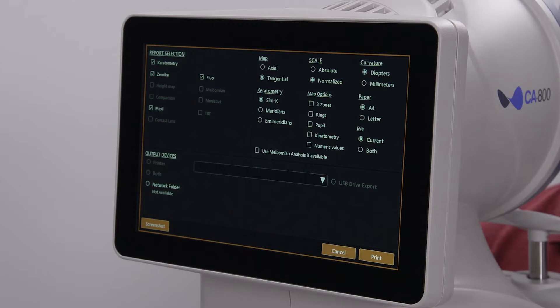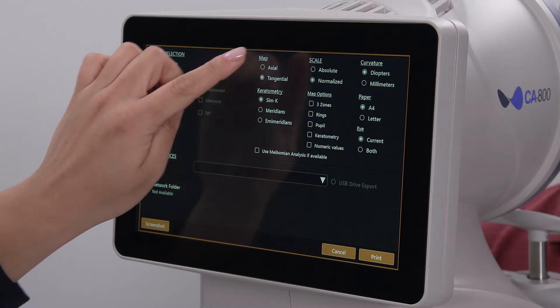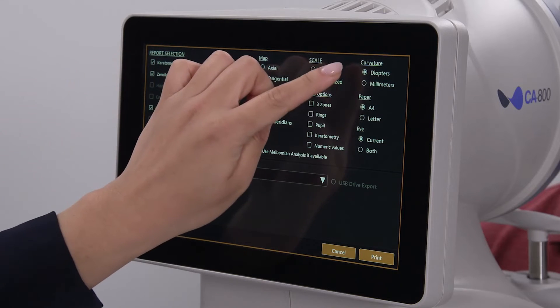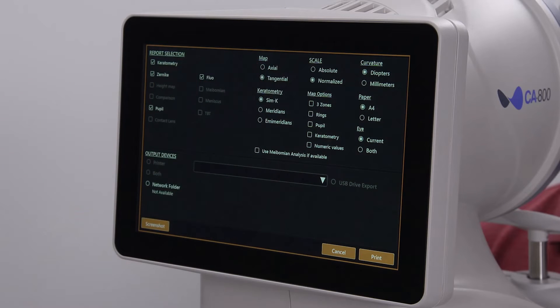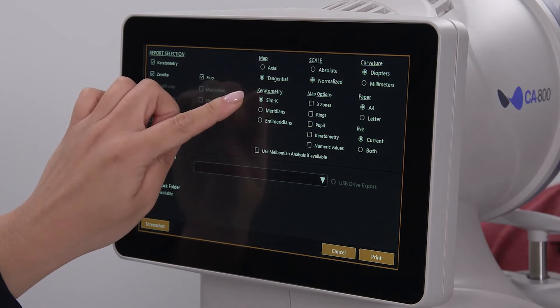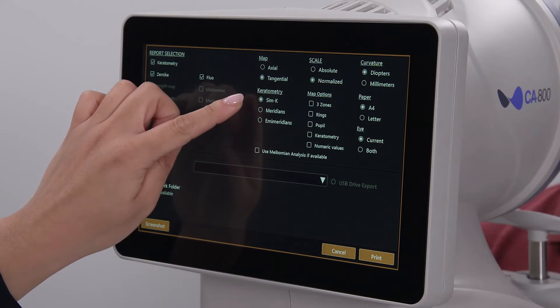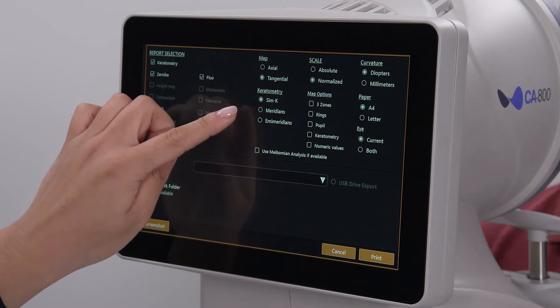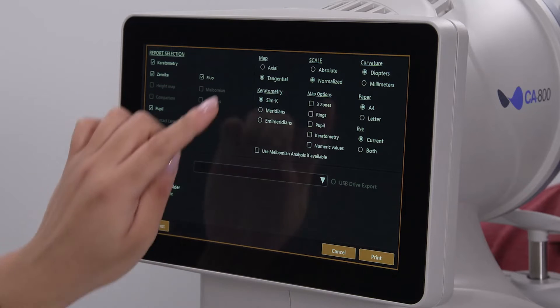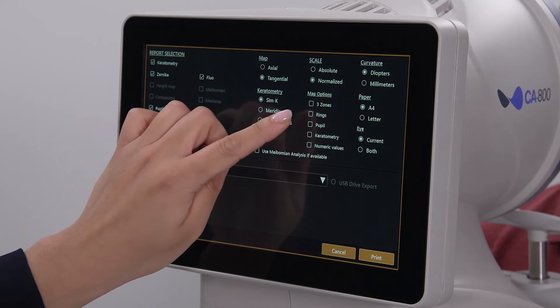You can select topography map type, scale type, and whether you want values displayed in diopters or millimeters. You can choose the type of keratometry values, either the SIMK or meridians or MM meridians. You can choose what overlays you want to see on the topography map.